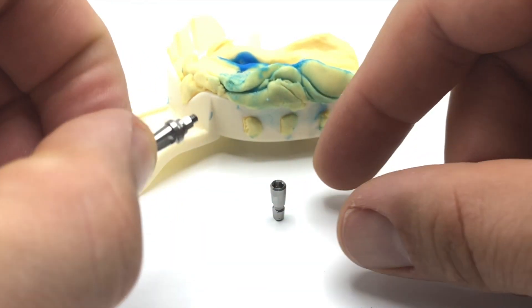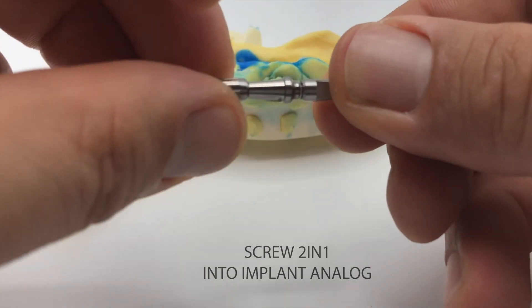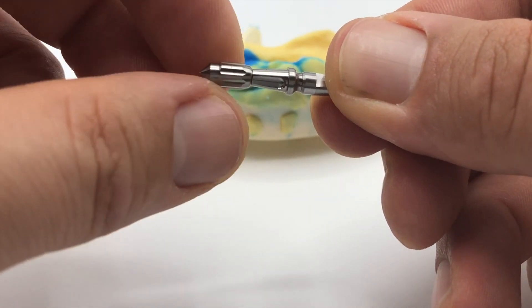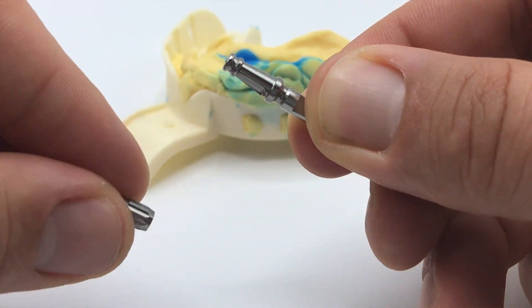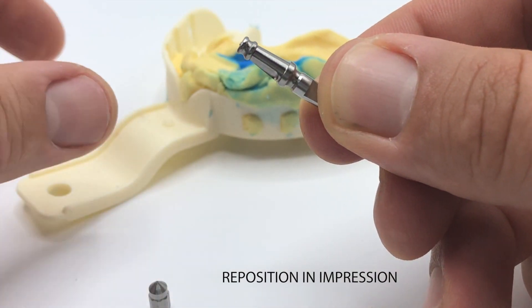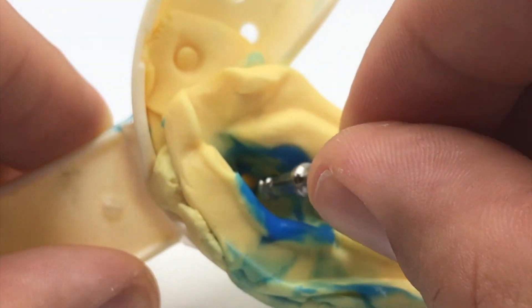To create the master model, screw the 2-in-1 impression abutment into the implant analog. Remove the handle from the impression screw and reposition the 2-in-1 impression abutment and the analog precisely into the impression.